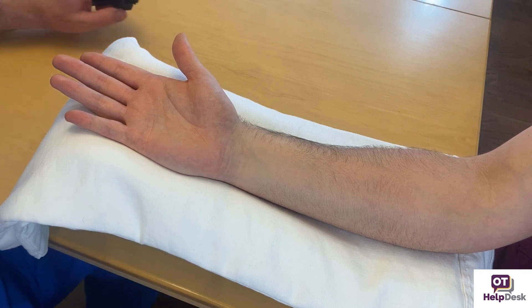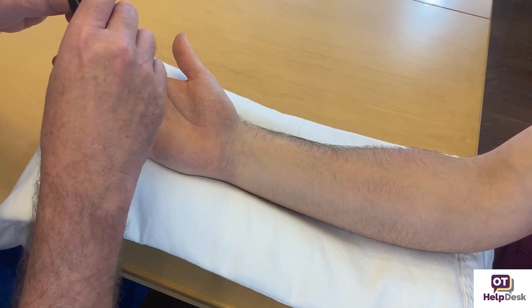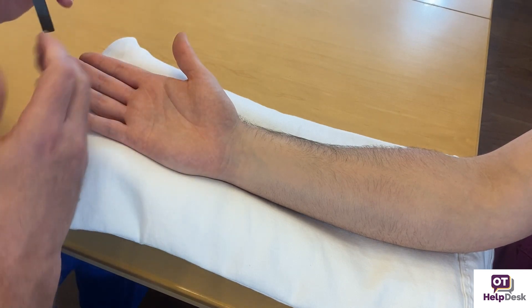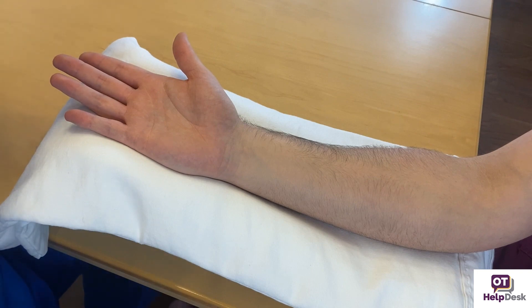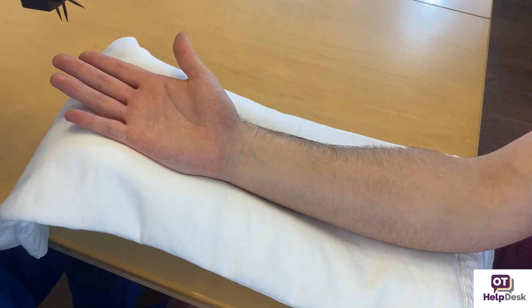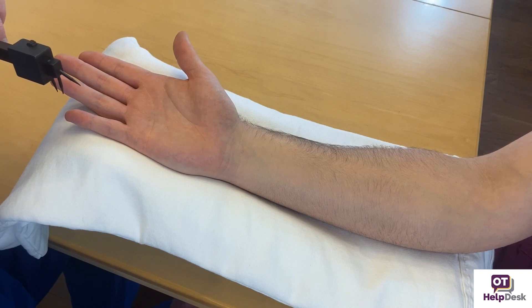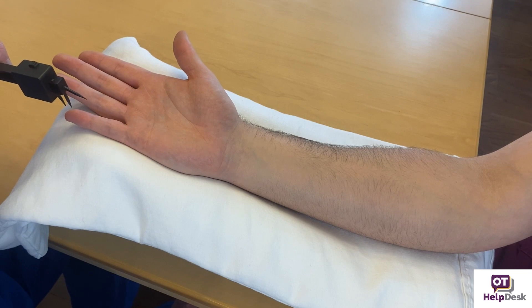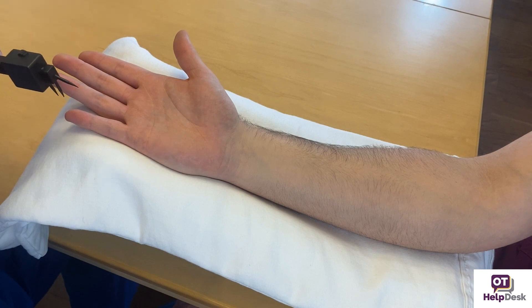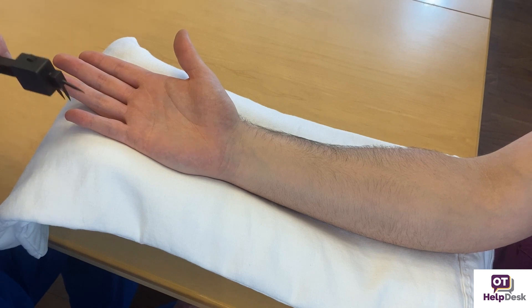Now we're going to test static two-point discrimination. We start in the unaffected hand. I've set the distance at five millimeters. We're going to test longitudinally because of the way the nerves are distributed. Joseph's vision is occluded. Joseph, do you feel one point, two points, or nothing at all? — Two.